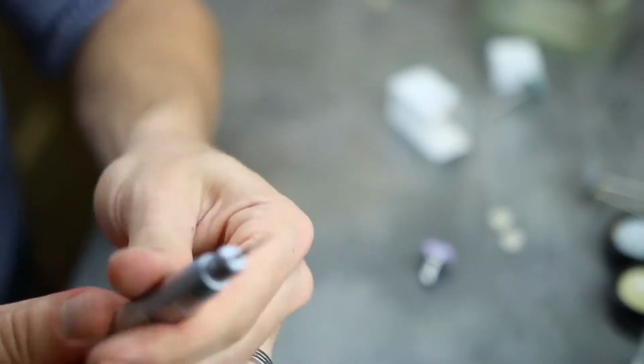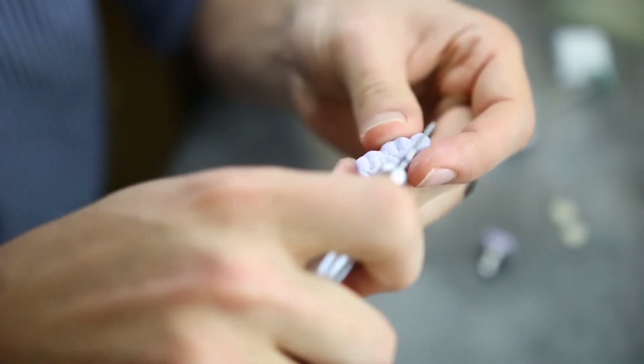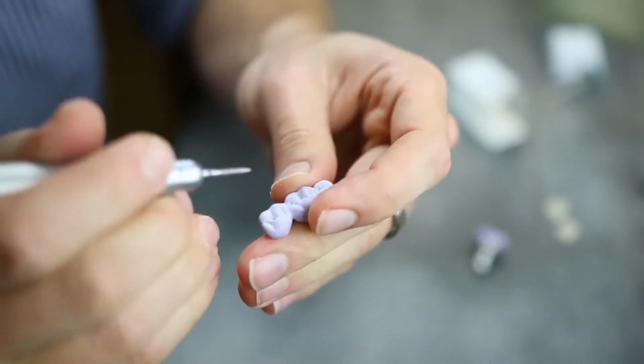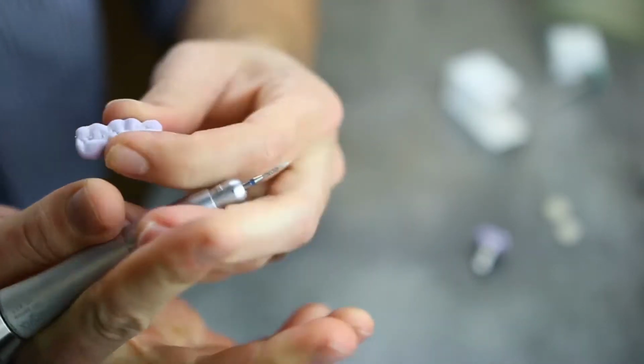In this case, sometimes it's useful to change your grip, just so that you've got a different way to, I like to use the word caress, to follow the anatomy of the teeth to accentuate further into the fissures.